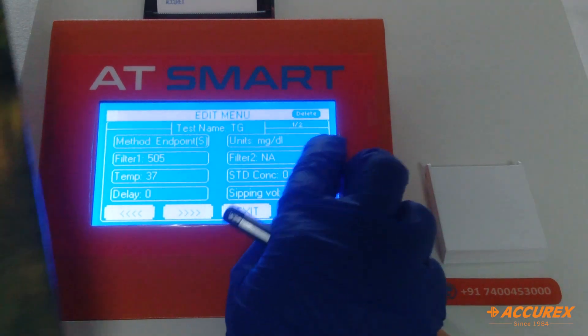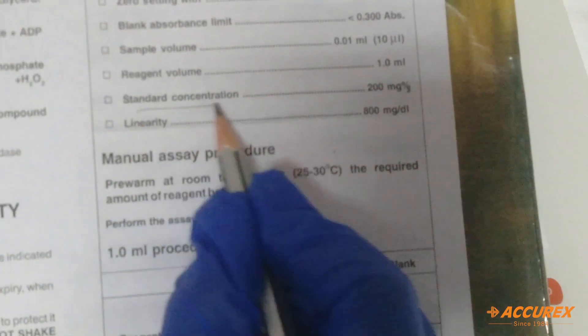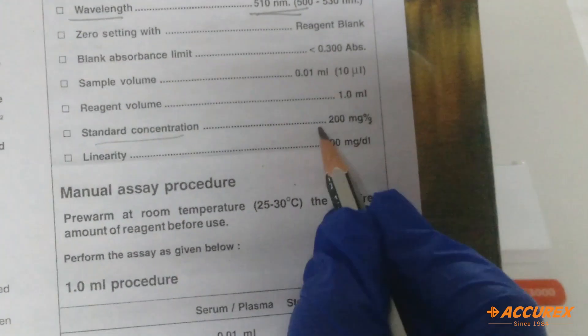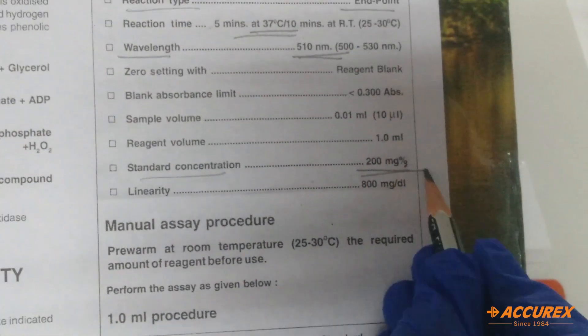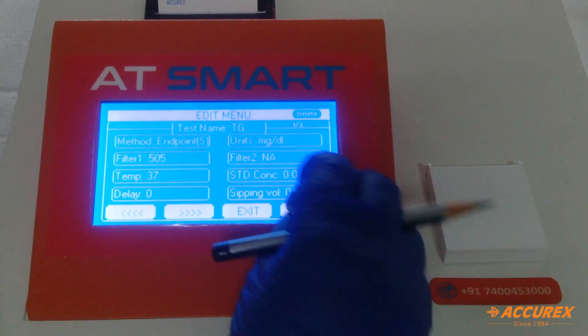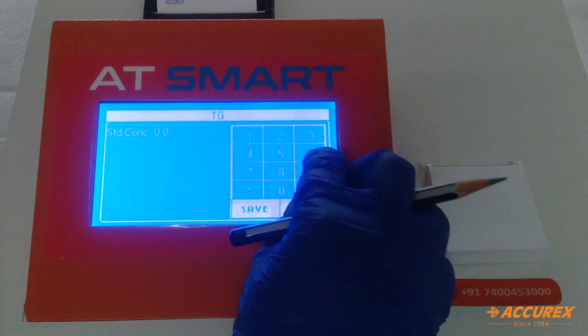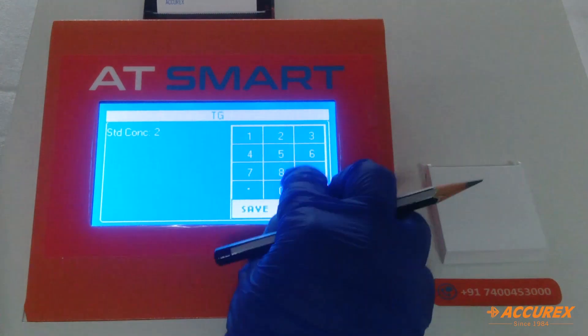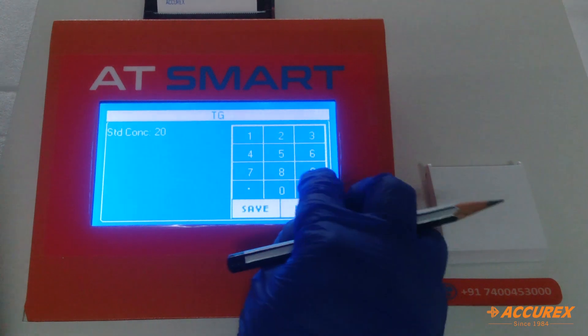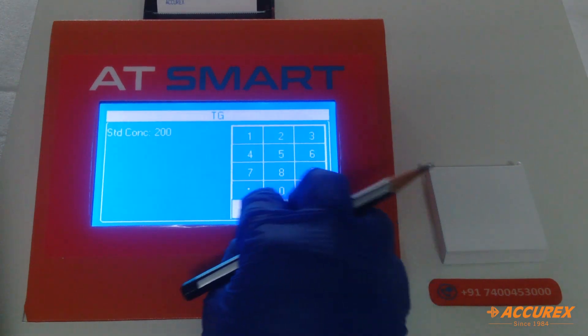For standard concentration, the value is 200 mg percent. Type 200 and save.